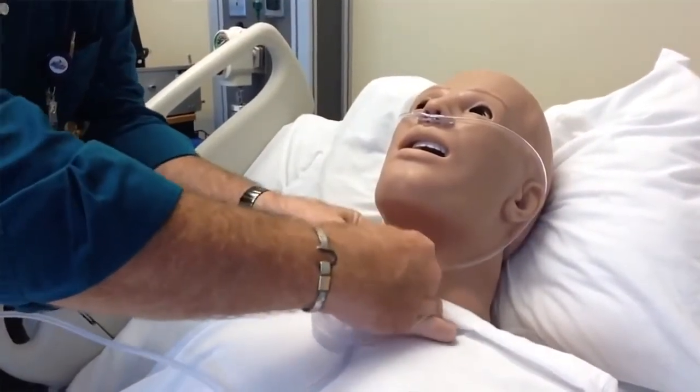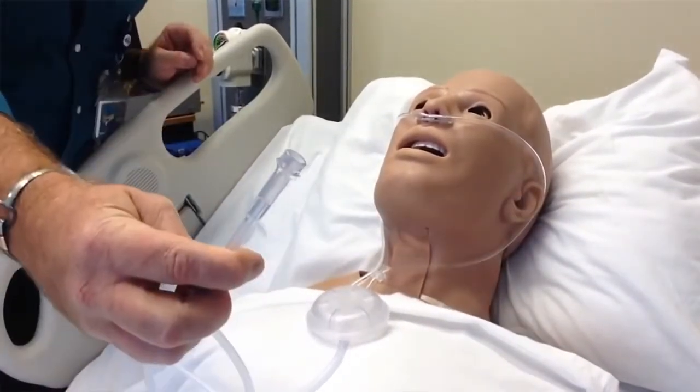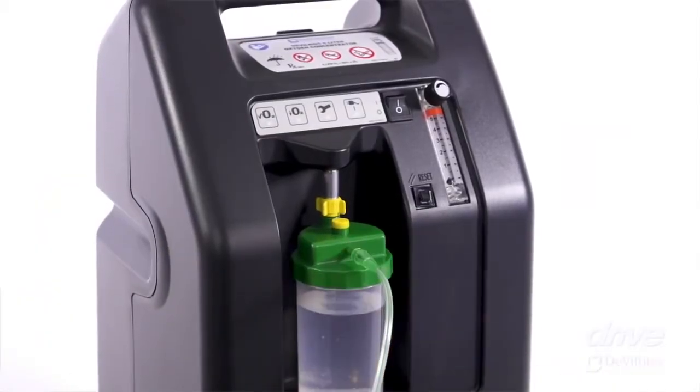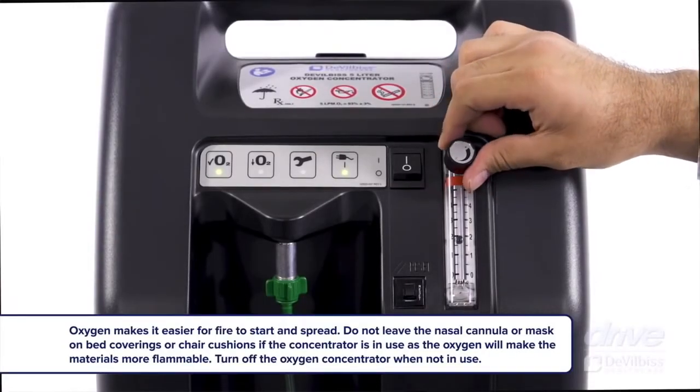The tube is then connected to the oxygen tube that comes from the oxygen concentrator. So it attaches to the oxygen concentrator, then you set it to the level required. It can be 2 liters or 3 liters. Alternatively, if it's an oxygen cylinder, it's the same mechanism and you connect it to the oxygen cylinder.